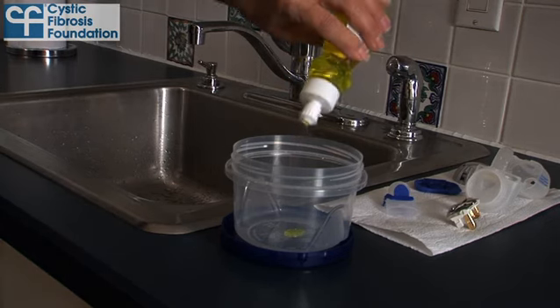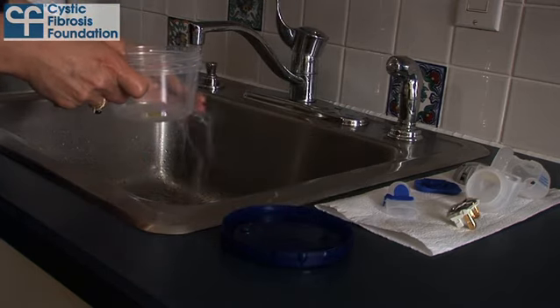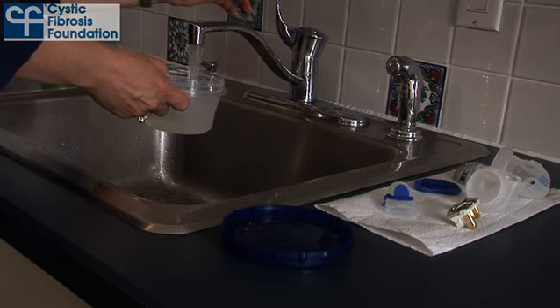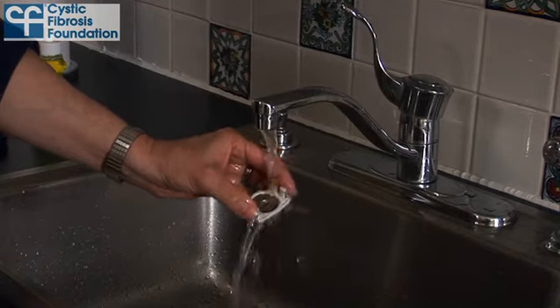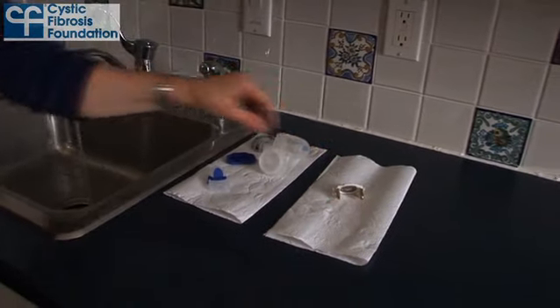Next, add a few drops of clear liquid soap to your clean bowl and add warm tap water. Do not use anti-bacterial soap or white liquid dish soaps like Ivory, because these might damage the nebulizer handset. Wash your aerosol head in the bowl and then rinse it under warm running tap water and place it on a clean lint-free towel or paper towel.